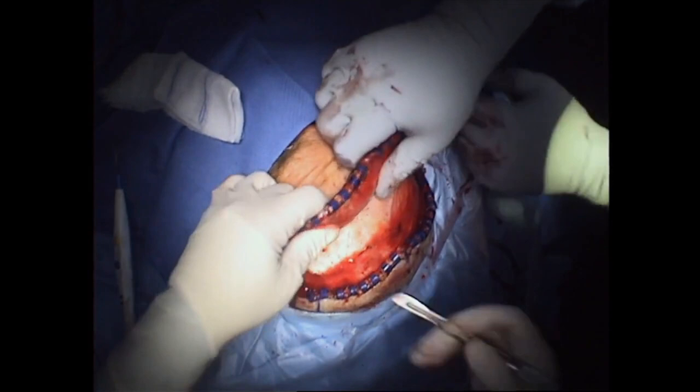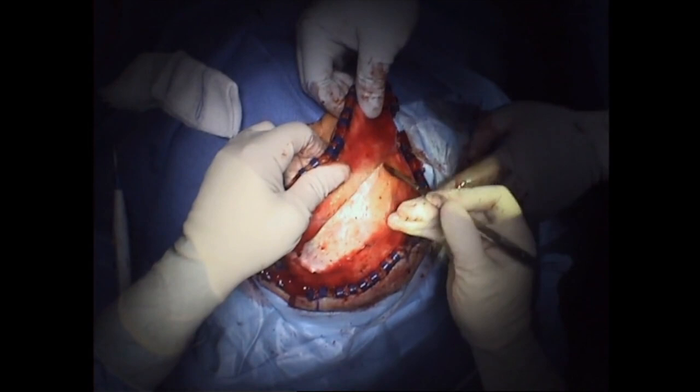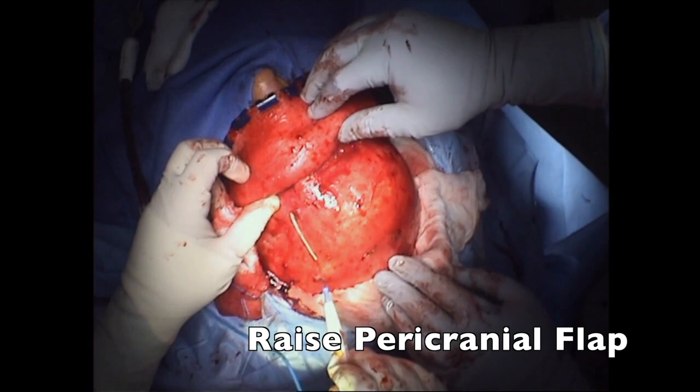In this case, we are leaving the pericranium down onto the cranium itself and will raise that as a separate flap. This allows for a very nice, robust reconstruction option when you're doing a combined open and endoscopic approach.